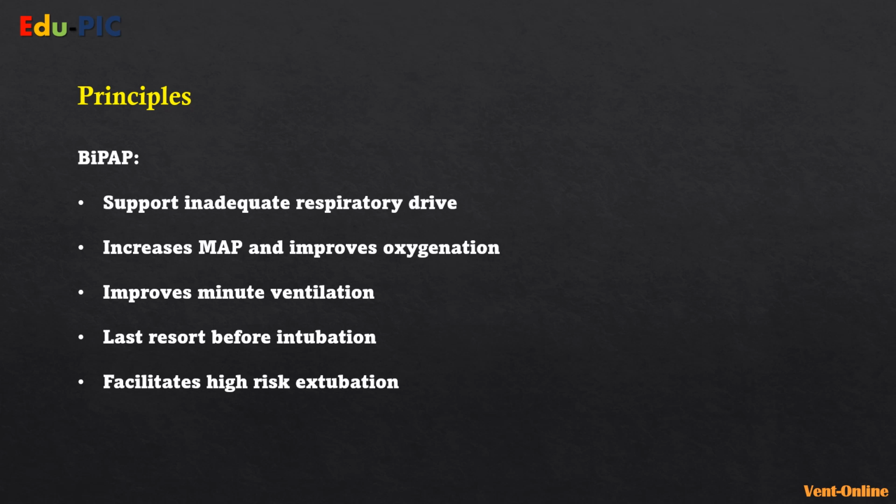But it also facilitates high-risk extubation. So if you're extubating a patient and you're not really sure about their drive, maybe coming out of sedation, or you're not sure about their airway or their ability to maintain their drive after being extubated, then this is a good mode for extubation that would sometimes protect you from re-intubation.